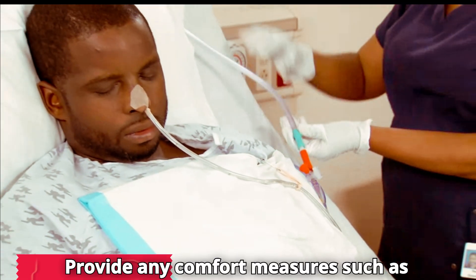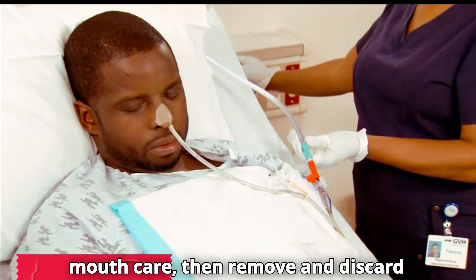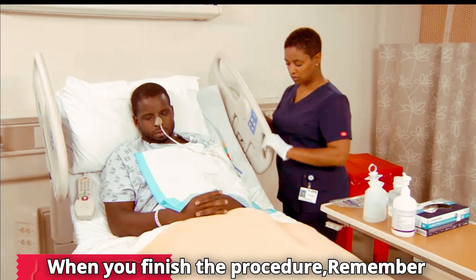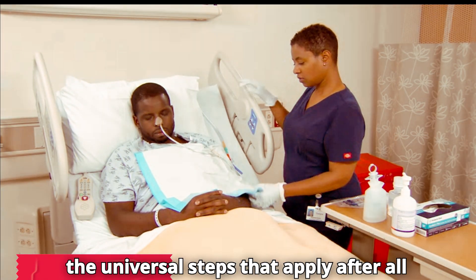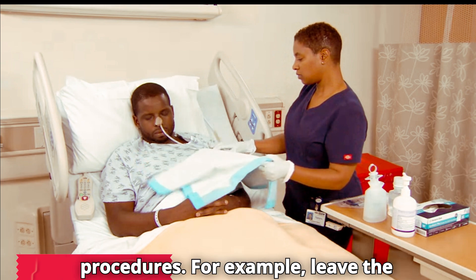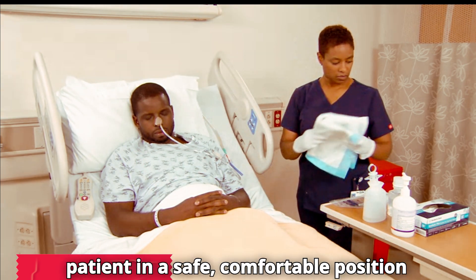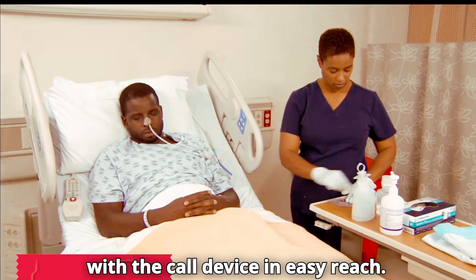Reattach the NG tube to the patient's clothing with a pin or tape. Provide any comfort measures, such as mouth care. Then remove and discard gloves and perform hand hygiene. When you finish the procedure, remember the universal steps that apply after all procedures — for example, leave the patient in a safe, comfortable position with the call device in easy reach.